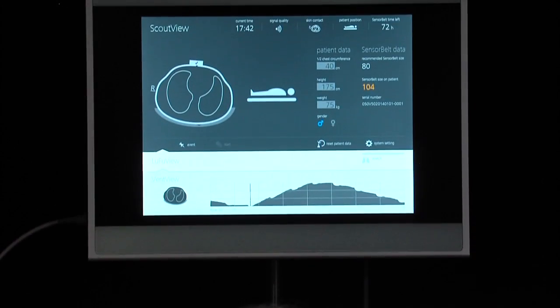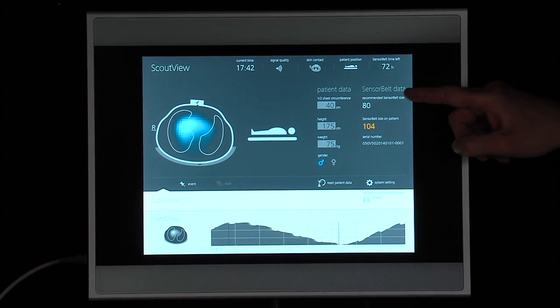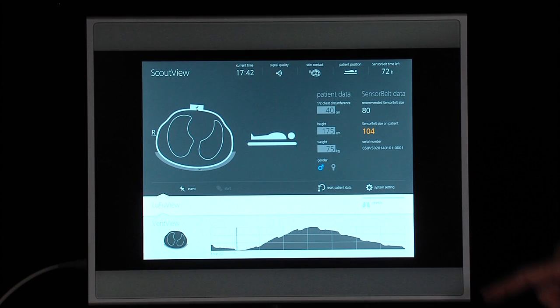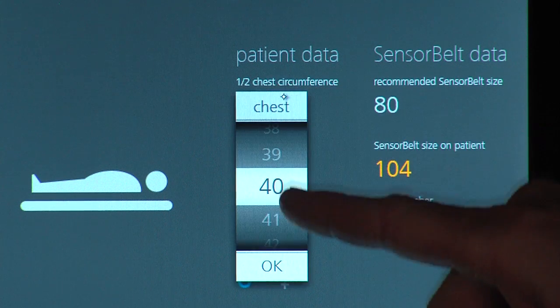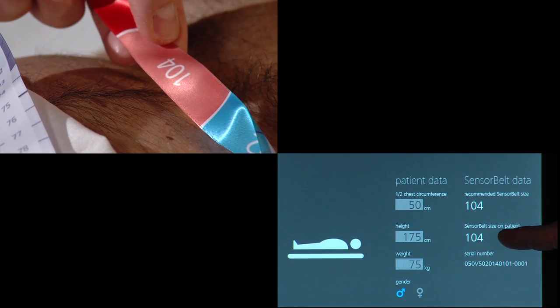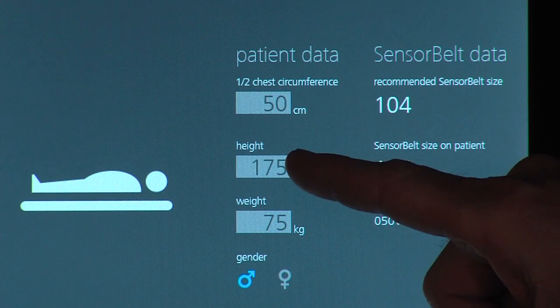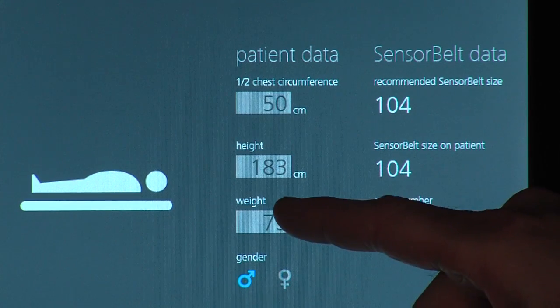The monitor provides on its right hand side a field for patient specific data inputs. The sensor belt size on the patient's body is automatically identified. In this example, size 104 shows up in yellow because the patient's chest circumference is not yet known to the system. Therefore, enter half the chest circumference you determined before — thus 50 cm. Once this number has been entered, the recommended sensor belt size is displayed — once again 104. Finally, enter the patient's body height, actual weight, and gender to individualize calculations.